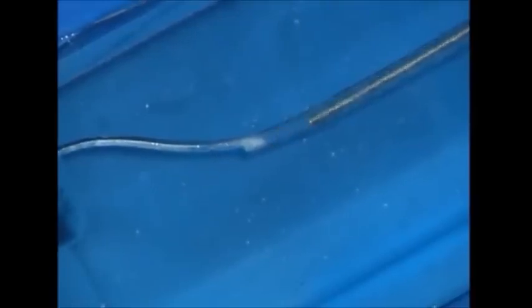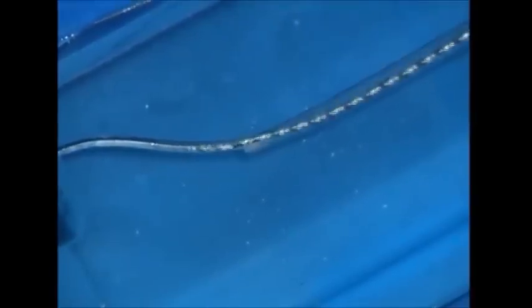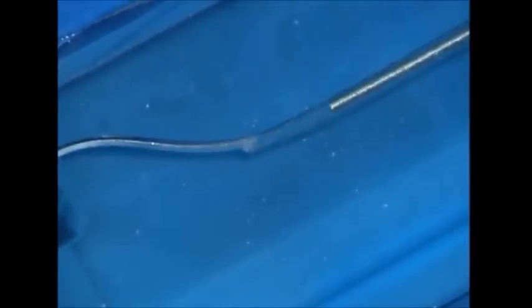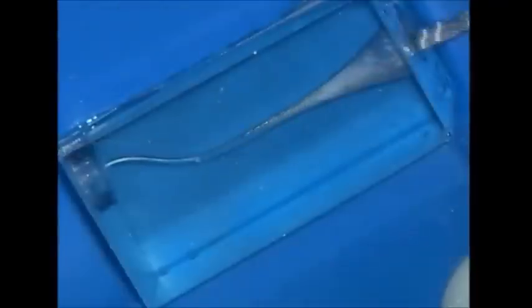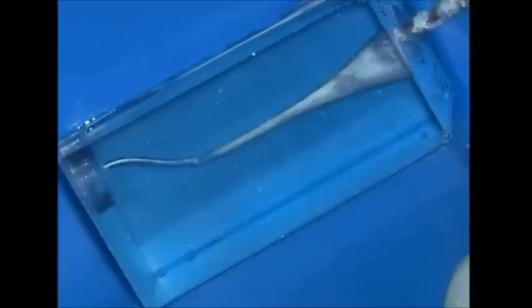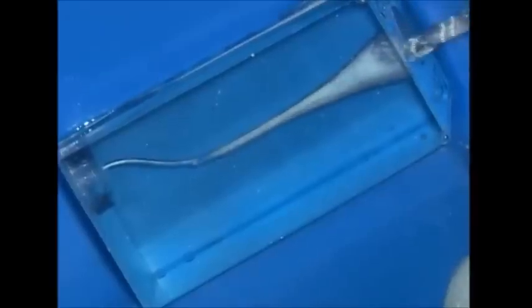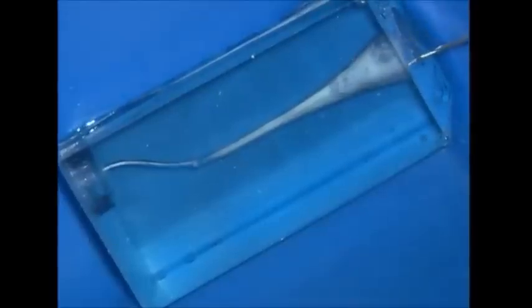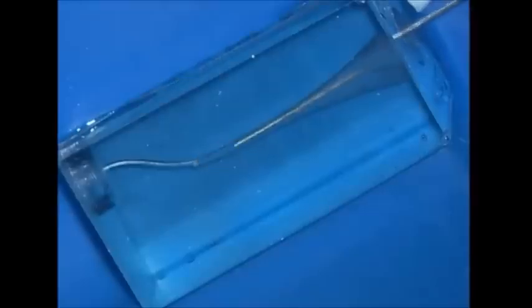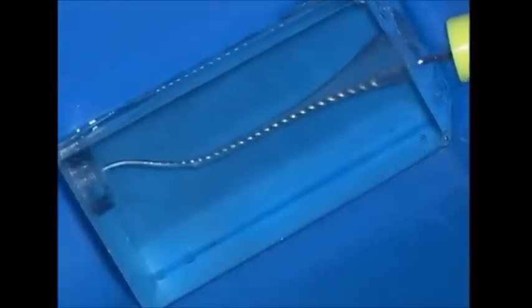Remember to work in a fluid-filled canal. Again, the pre-curved small hand file more predictably now bypasses the ledge, works deeper into the canal, and continually refines and expands the glide path. We use a ProTaper Shaper 1 to flare and brush cut the coronal portion of the canal and improve access. This generates quite a bit of debris and necessitates continuous irrigation procedures after each rotary instrument.